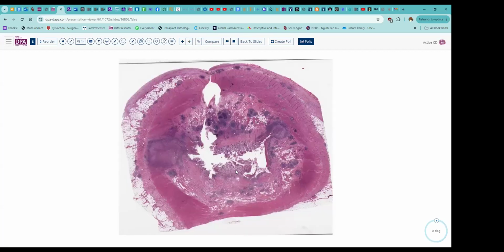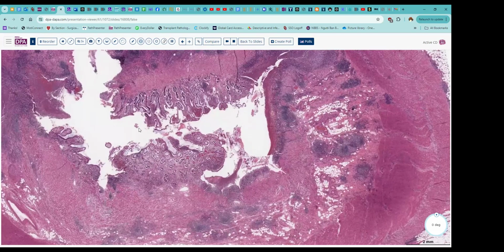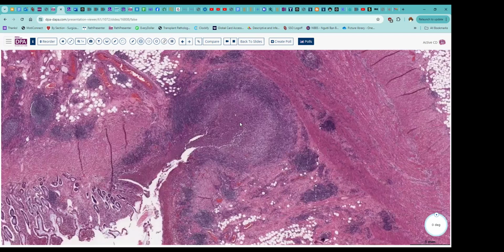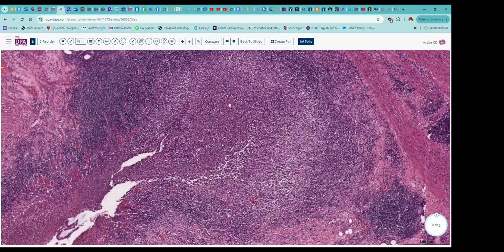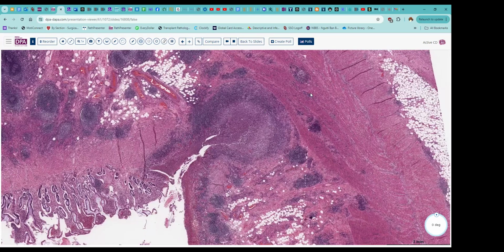All right, well, we're just about to the end of the hour. I think we've got one more active Crohn's disease case here that we'll go through. And this again shows a pseudopolyp, where you see an area of ulceration, and here's a nice fissuring ulcer. As you see, it just sort of dives. It's a deep canyon going down in here. You see the necro-inflammatory debris here. In this case, it's reaching the muscularis propria and forming that fissure.